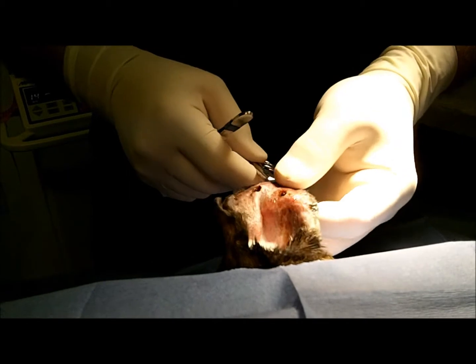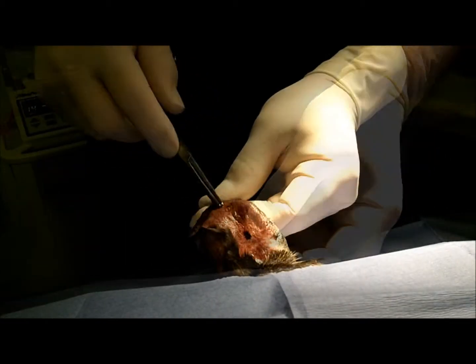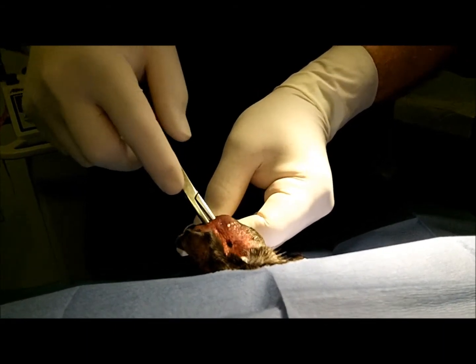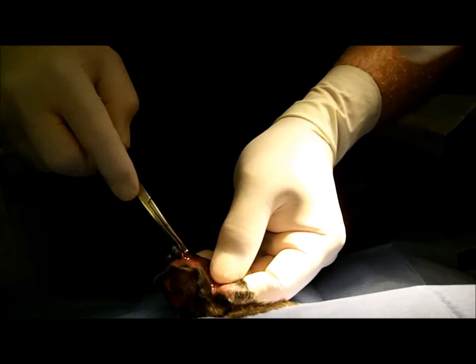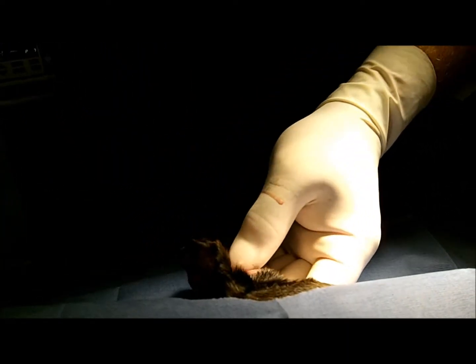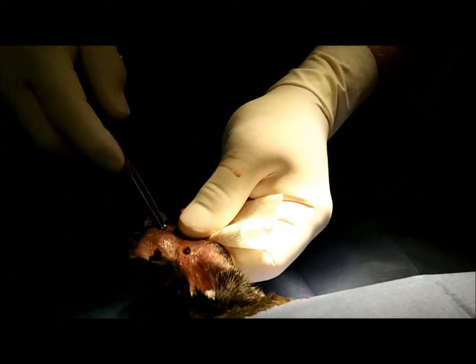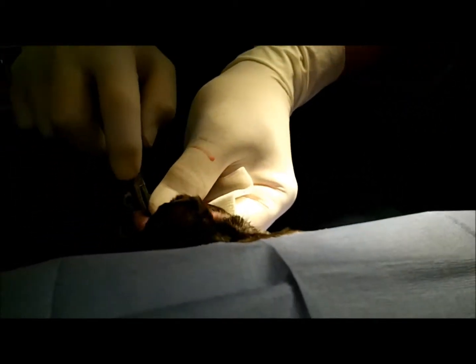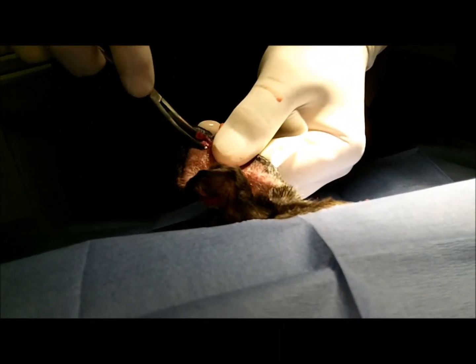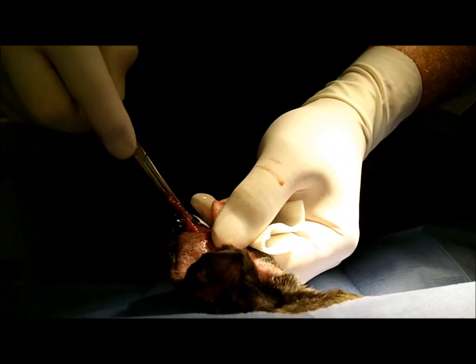We've got several larger draining holes there. I go in with a pair of forceps and I'm going to pull out some of the trash and debris that's collected in there, trying to help the ear heal in a more natural form. There's a lot of debris that will pull out, and you can see that little fiber accumulation there.